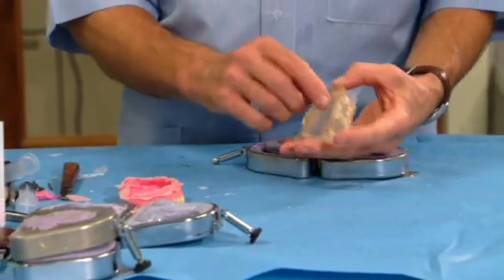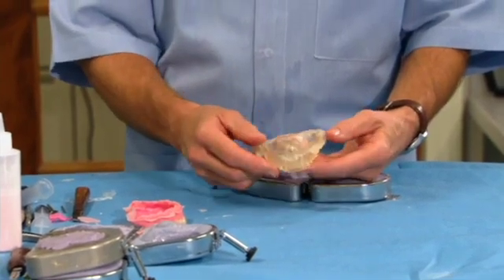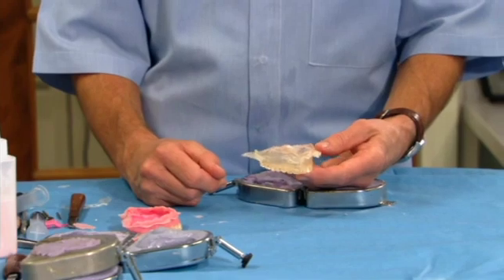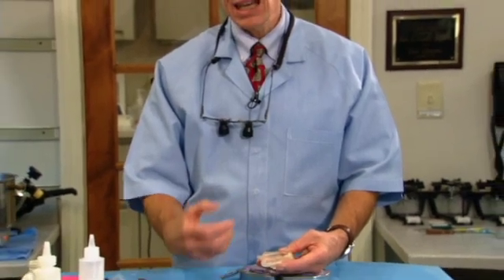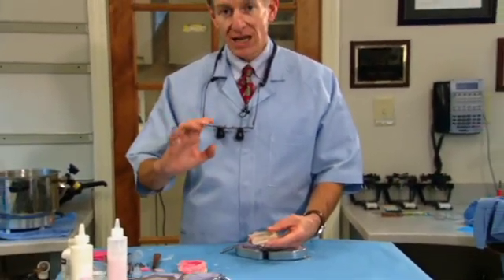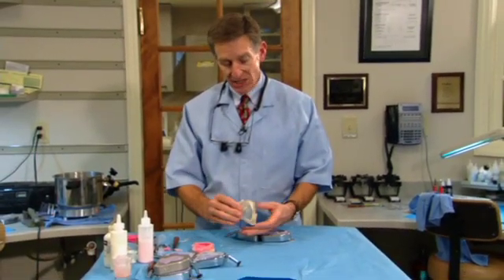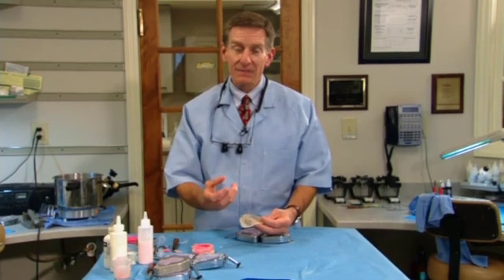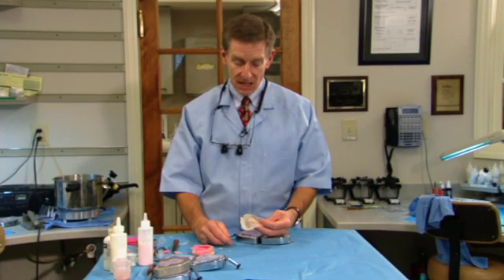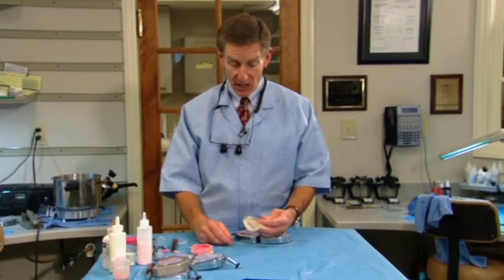Or if we wanted to place a couple of implants in the position of the bicuspids or in the canine area based on other information, this would serve as a great guide. The periodontist that I work with that places implants really loves having these because even if he has a surgical site exposed, even if he's got an area flapped, this will fit into the mouth. If you would just provide a suck down matrix to the periodontist, it would not fit in the mouth because it wouldn't have any stops. And so this is a great device to give to your referring dentist or your periodontist to use as an implant guide.